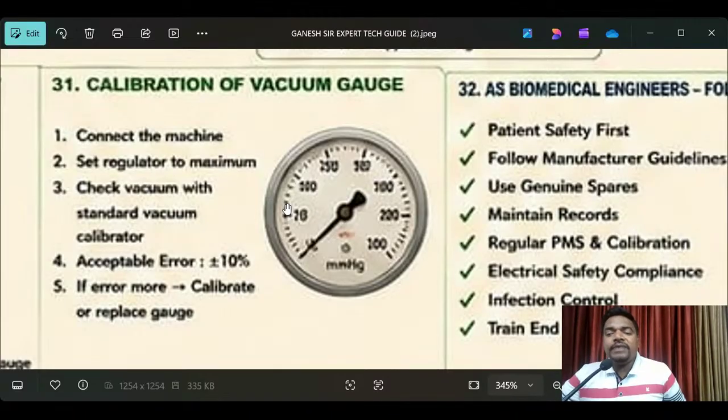So whenever you get a complaint from the hospital and only then do the work, that is not enough to survive in biomedical engineering. Before you catch the point, before the complaint is collected, find out the issues and resolve them. Every time, try to be an instant service provider. Definitely at the end of the day, you will give the best performance. So all these points are for biomedical engineers who are working as biomedical engineers, right? Now 31 points are successfully completed about the aspirator suction machine.